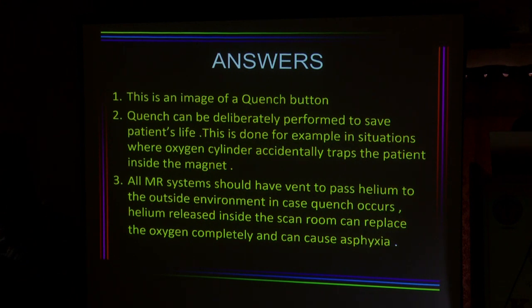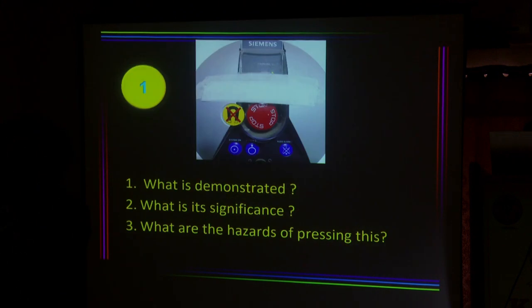Pressing the quench button: the MR system generally has a vent to pass the helium, and if a quench occurs, the helium inside the scan room will replace the normal oxygen, and this can cause asphyxia to the patient. So that is the main hazard of pressing the quench button.